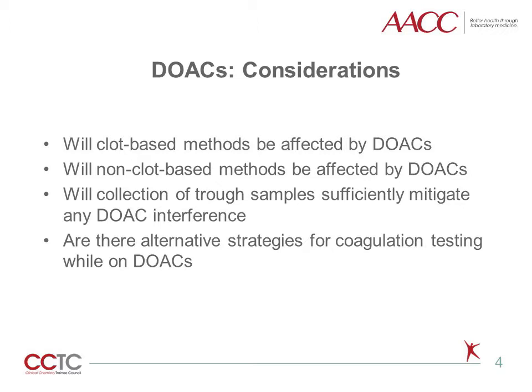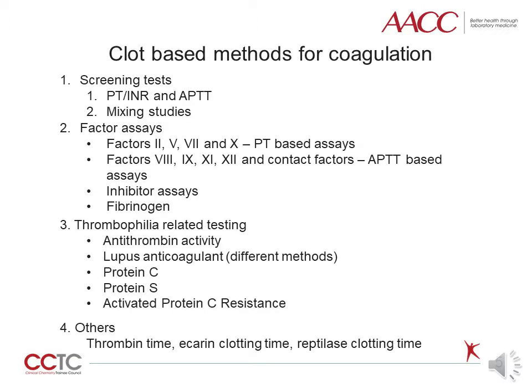Will DOACs also affect non-clot-based assays, such as immunoassays? As trough levels represent the lowest DOAC concentration in the patient, will trough collections mitigate any DOAC interference? And lastly, are there any alternative strategies for testing in the presence of DOACs? This slide represents a review of clot-based coagulation testing, including the screening test PT-INR and APTT, factor assays, thrombophilia testing, and other routine or esoteric assays. In prior pearls, we have extensively described the DOAC effect on screening tests such as the PT and APTT. As DOACs are inhibitors of activated coagulation factors, PT and/or APTT mixing studies may mimic an inhibitor pattern. In this session, we will describe a general overview of the effect of DOACs on more esoteric coagulation assays.